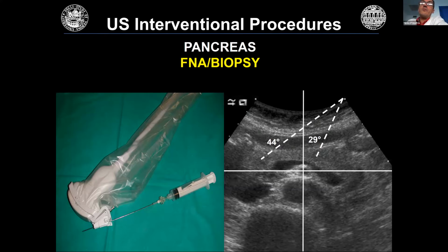What is very important is to have the probe, as you can see here, in a sterile position, and the devices are also sterile, but the devices need to be free to change the caliber if you need to change from 20 gauge to 18 gauge, just to improve the material that you will aspirate or biopsy. And this is also guided by the pathologist.